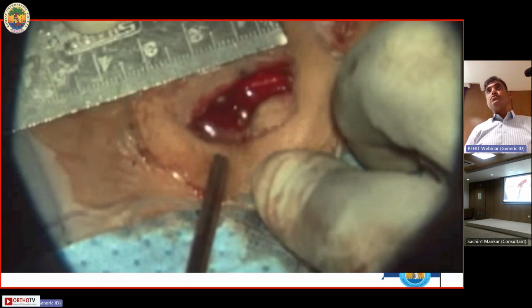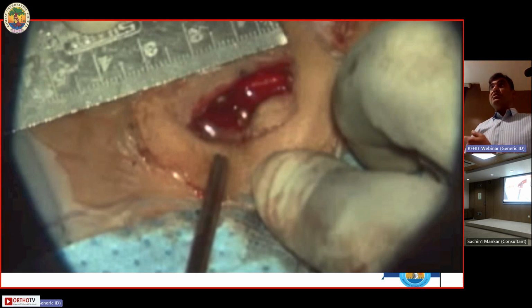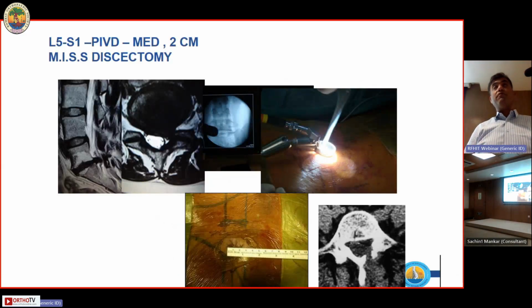The size of the incision in a simple single level procedure doesn't change much from a microdiscectomy. However, when you're doing a 2 level, 3 level, or in an obese patient, I think the advantages are absolutely clear. With nil dead space, the advantages can be even bigger, and even in patients with a dural leak, this is far more forgiving than any microlumbar discectomy.